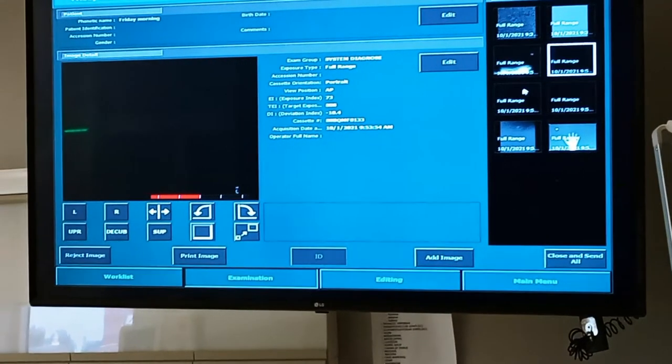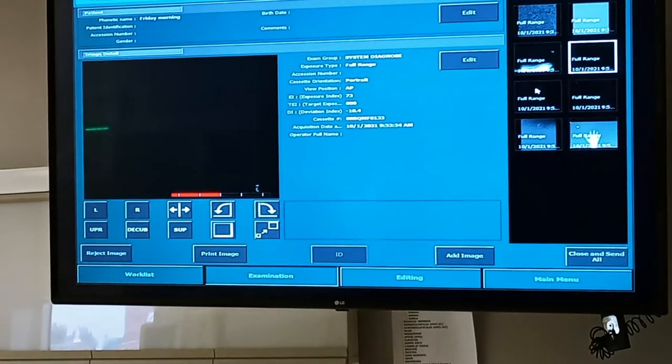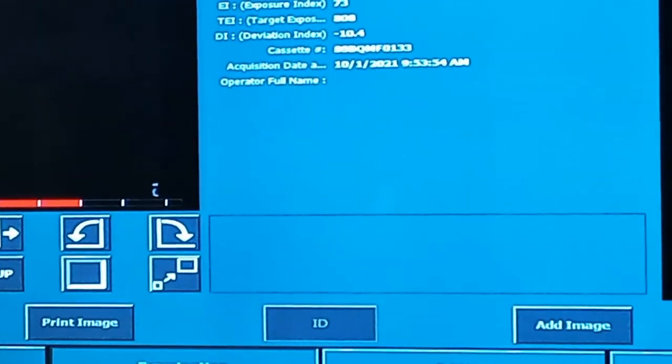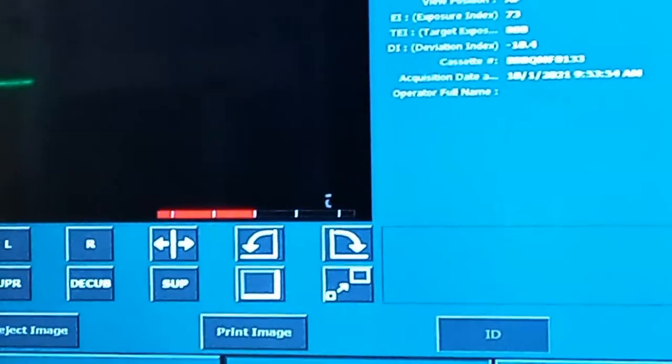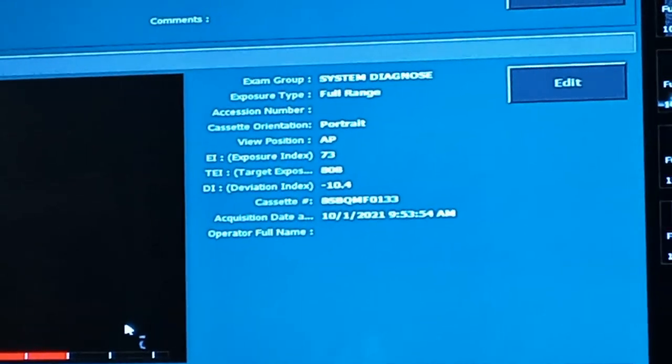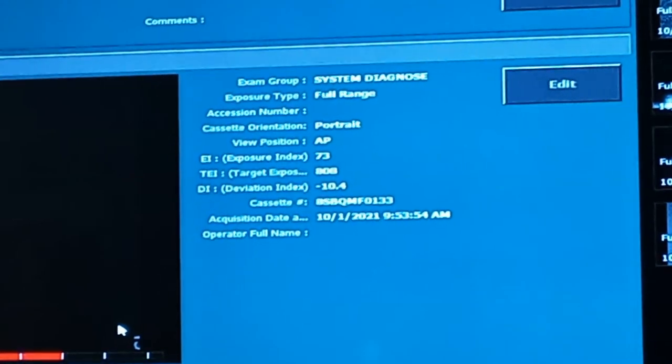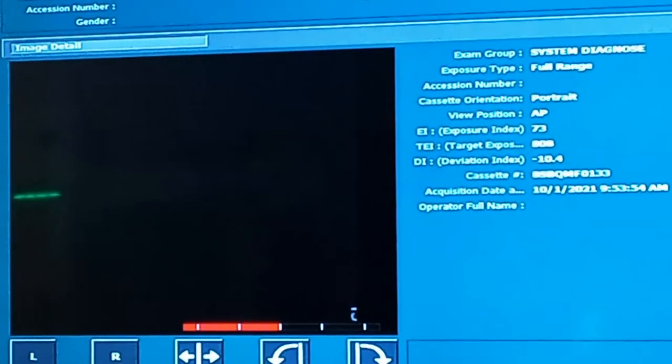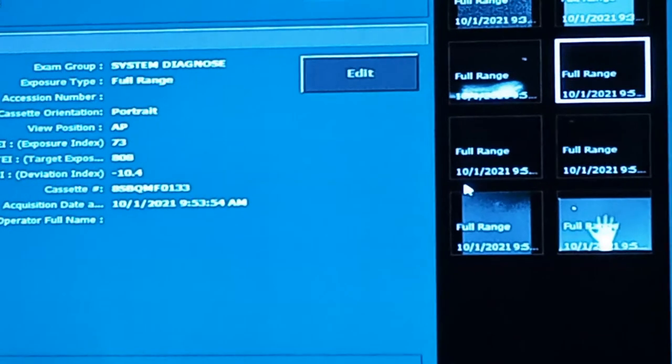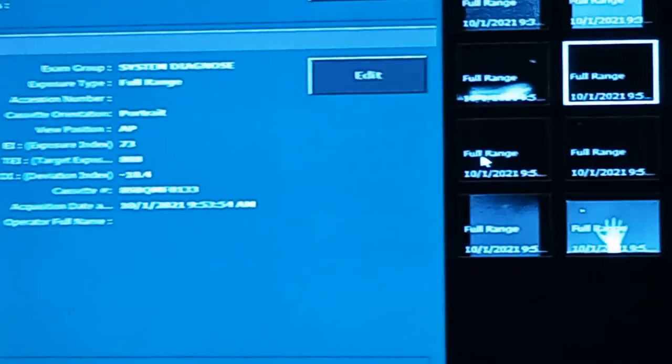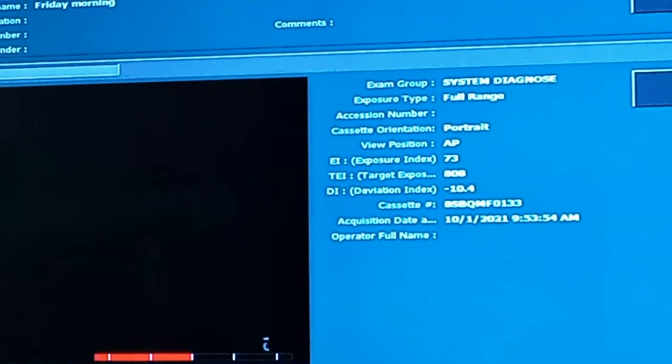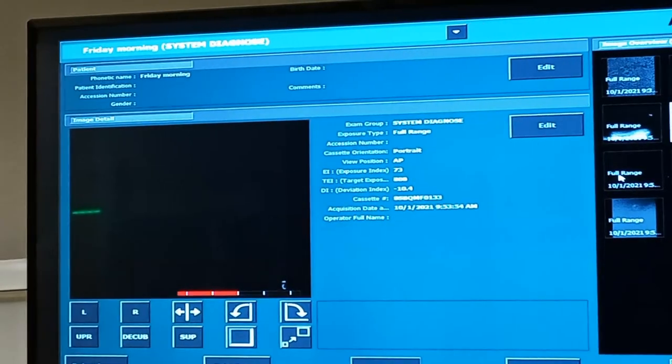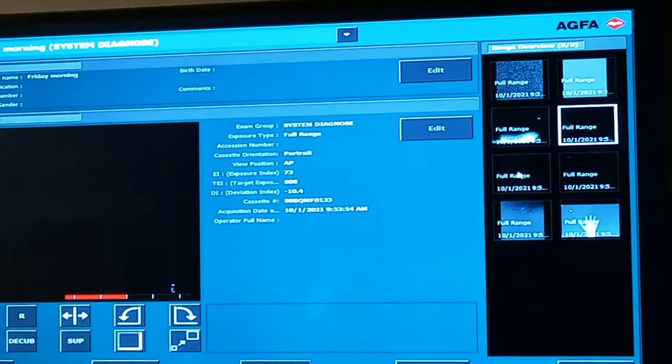I can't see. How many feet away from the patient was this? 13. Okay, there it is in the corner. So at 13 feet away from the patient, we had an exposure index of 73. So even though we're back a good distance, can we get 13 feet away from the patient in somebody's room if we're doing portables? Probably not. Some of these rooms are pretty small. Okay, so take us to the next image.